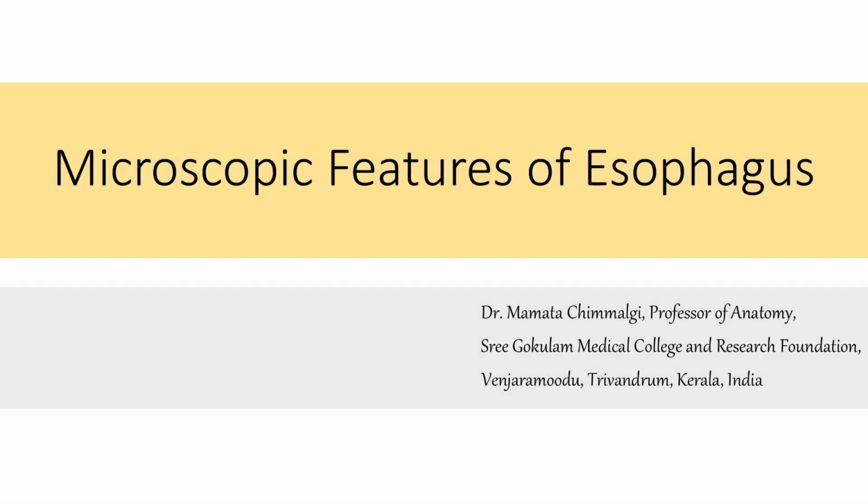Let us consider the microscopic features of esophagus in this video.